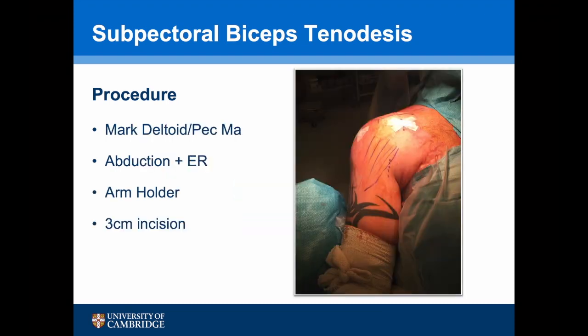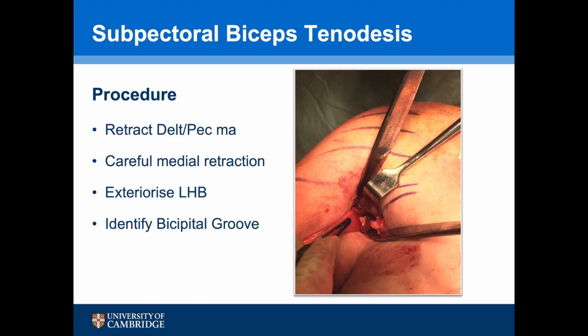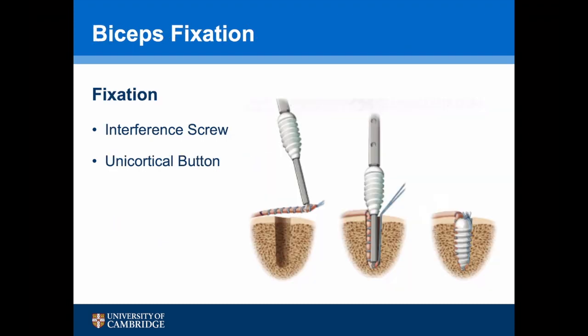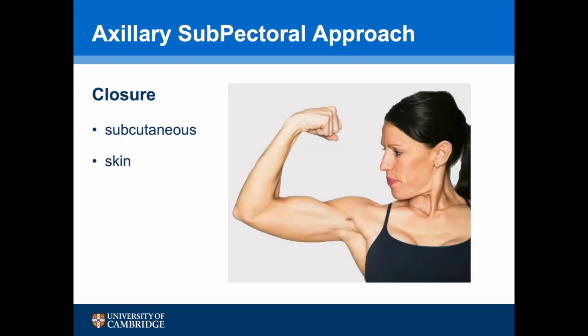Having performed the tenotomy, the wounds are closed and the inferior edge of the deltoid and the incision position are marked out. The arm is then abducted and externally rotated — I prefer to use an arm holder, but an assistant can do this. The incision is made, the subcutaneous tissues are traversed, the deltoid is retracted laterally, and pec major is retracted superiorly. Care is taken not to apply too much traction to avoid a musculocutaneous nerve palsy. The long-headed biceps is then identified and exteriorised, revealing the bicipital groove at the bottom of the incision. The stump is prepared with a whip stitch and secured using either an interference screw or, as I prefer, a unicortical button. The wound is then closed in layers.